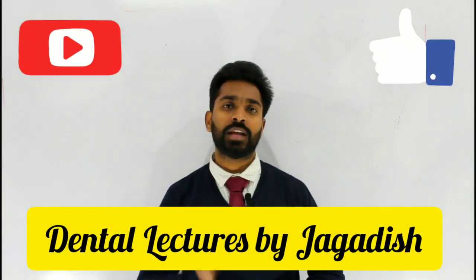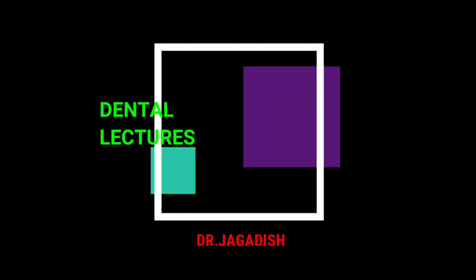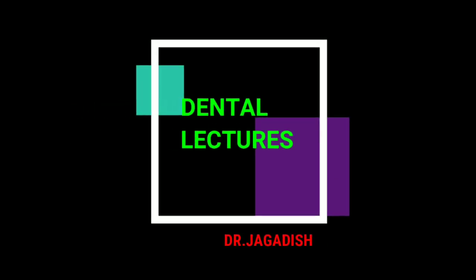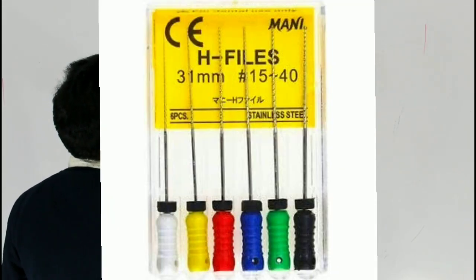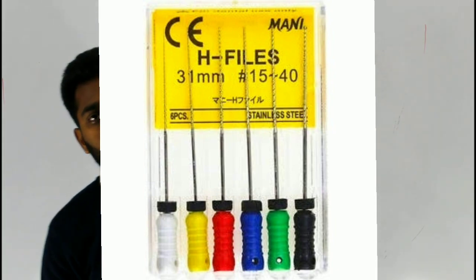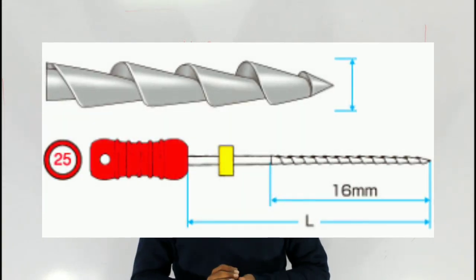In this session I am going to discuss about H-Files. H-Files are called Hedström Files. These are hand-operated endodontic instruments.